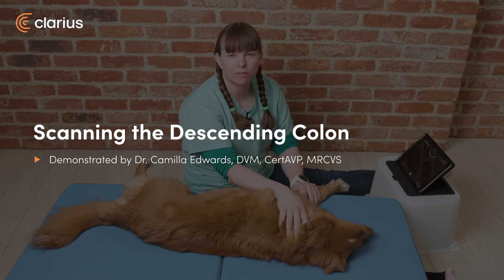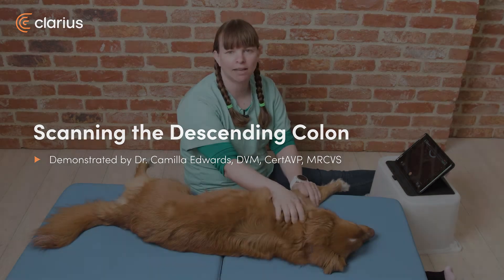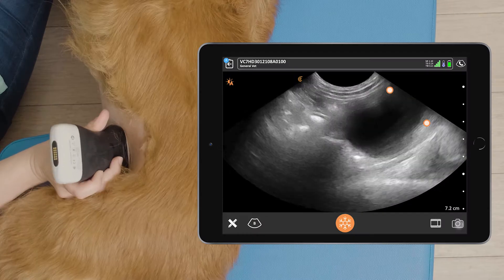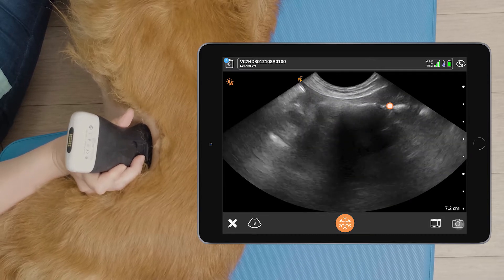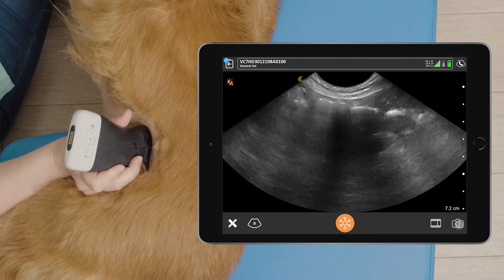Hi, I'm Dr. Camilla Edwards from First Opinion Veterinary Ultrasound and today we'll be looking at how to scan the descending colon. So we'll find the descending colon above the bladder. When we first find the bladder, we slide dorsally and this gas-filled structure up above it is the descending colon.